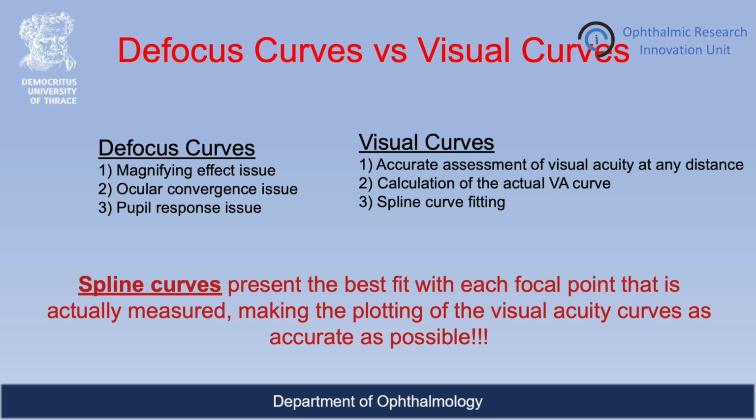The visual curves resulting from the use of DART impose a crucial improvement over the traditional defocus curve procedure, addressing a series of drawbacks that defocus curves cannot address. First of all, defocus curves don't take into account the magnifying effect caused by the use of the trial lenses, as well as the ocular convergence and the pupil response.